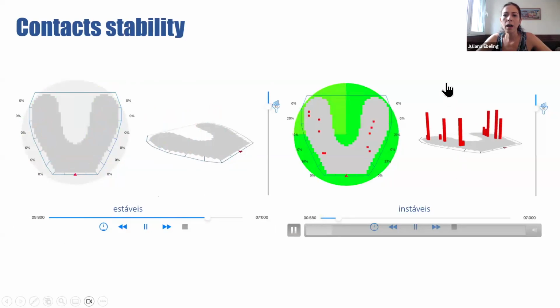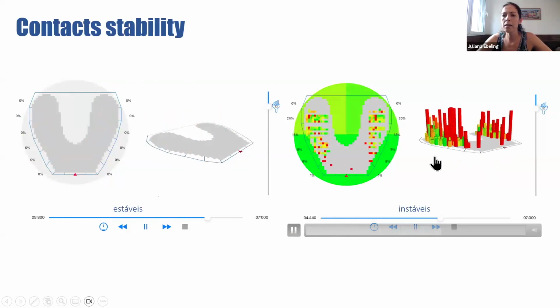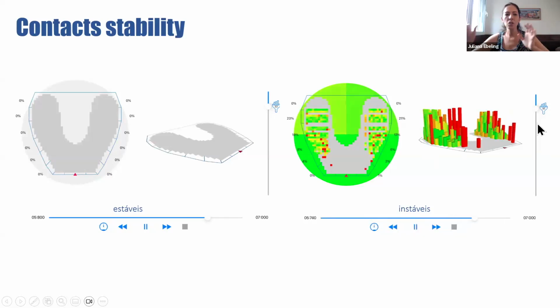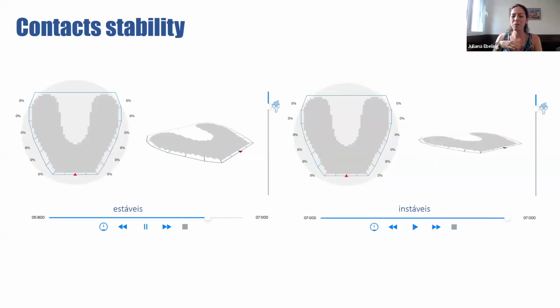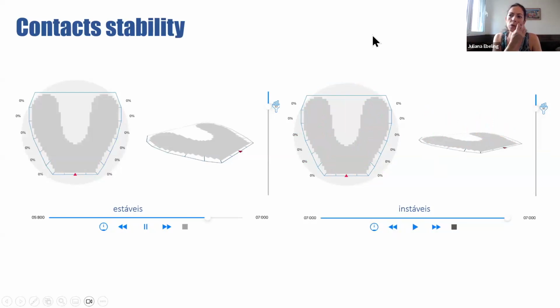When I record, open and close, a completely different pattern, open, close, normally these patients, when we ask them, say, yes, I have 2 or 3 different places to close. And this is very useful information about how stable this system is, and it drives us to look with more attention and more care at this system.